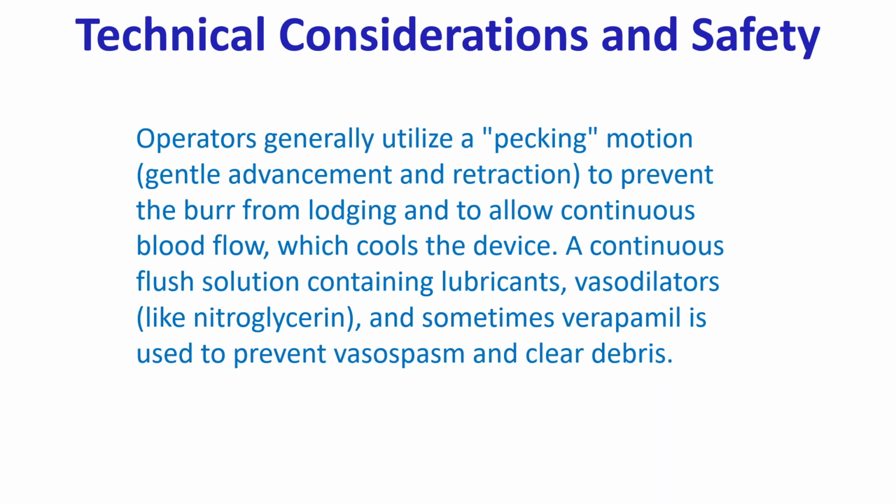Operators generally utilize a pecking motion, gentle advancement and retraction, to prevent the burr from lodging and to allow continuous blood flow, which cools the device. A continuous flush solution containing lubricants, vasodilators like nitroglycerin, and sometimes verapamil is used to prevent vasospasm and clear debris.